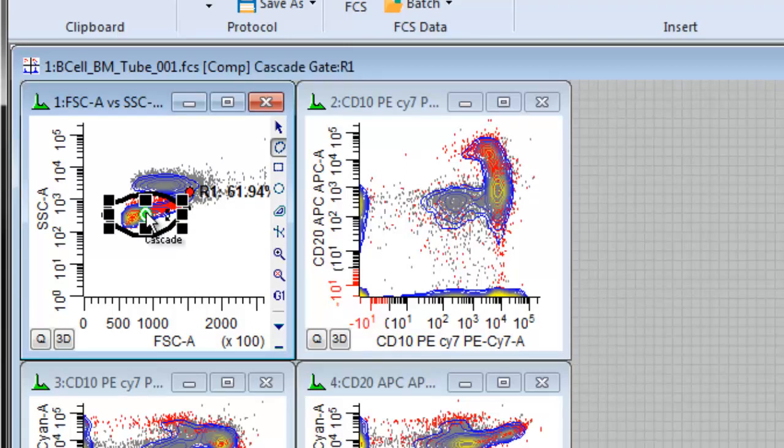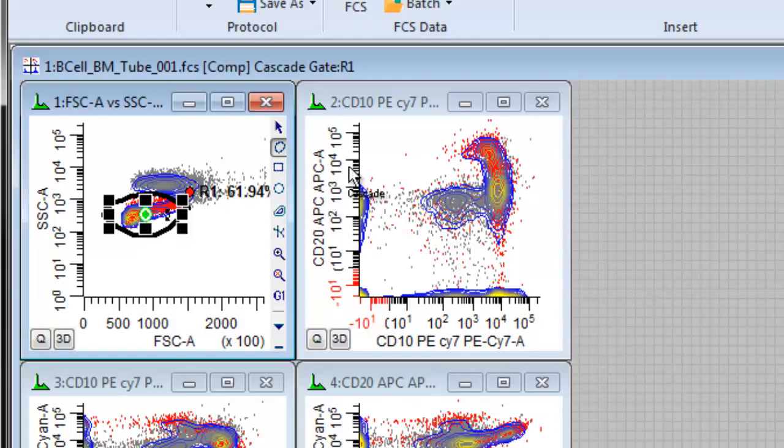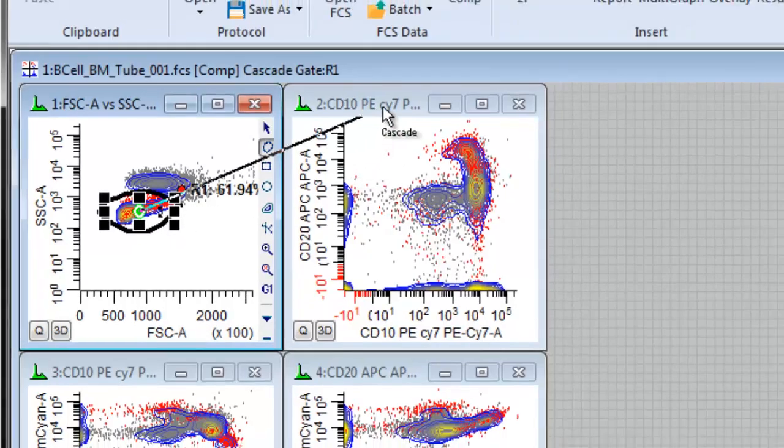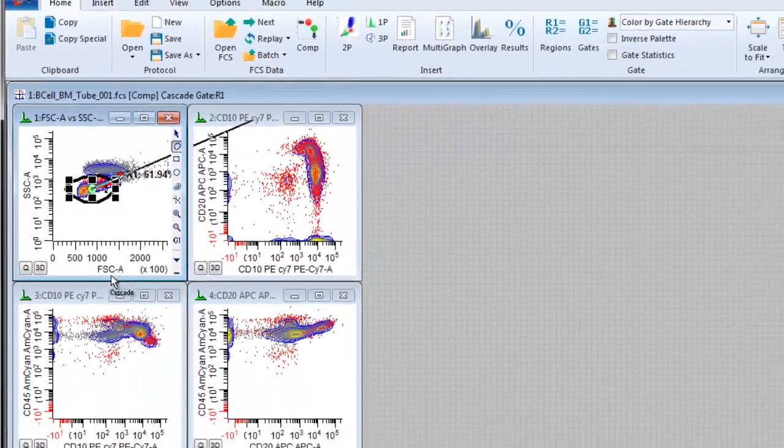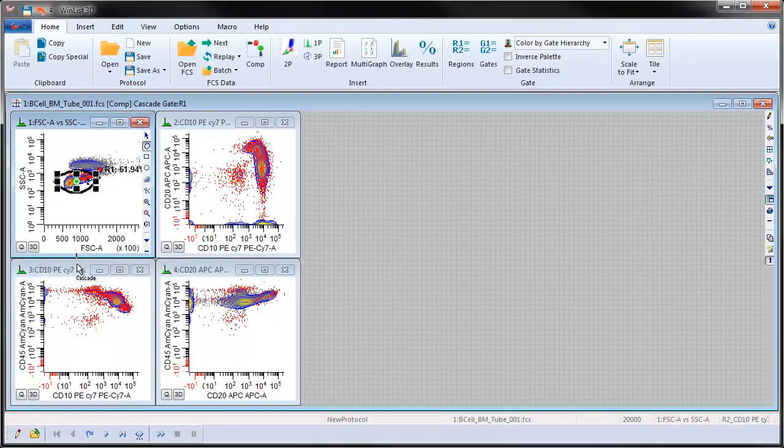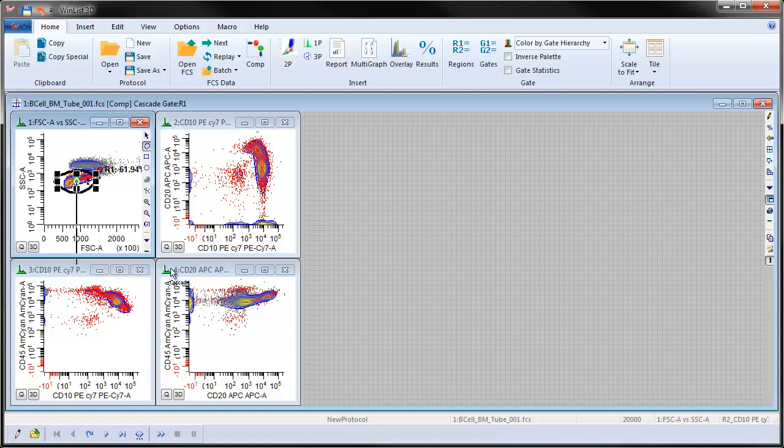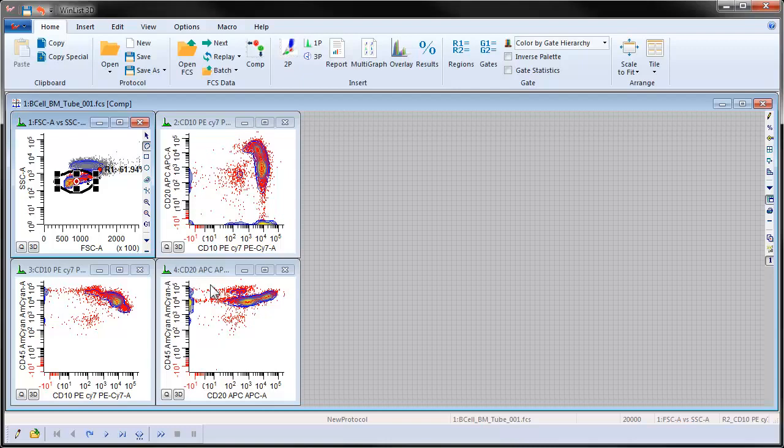With R1 drawn, now click on the red hotspot in the middle that we call the Cascade Gate Spot. Hold down the Shift key and click and drag the line to the title bar of the histograms to be gated. Let up the Shift key before clicking the last title bar.